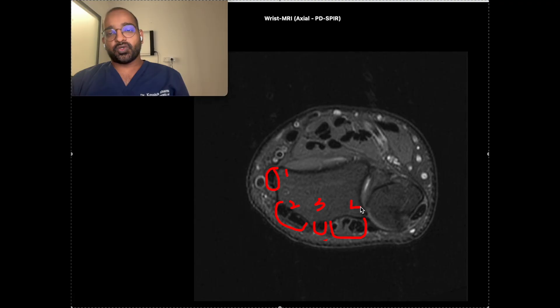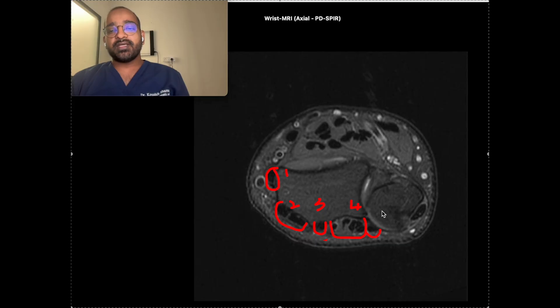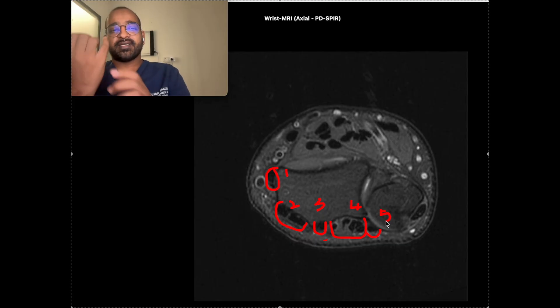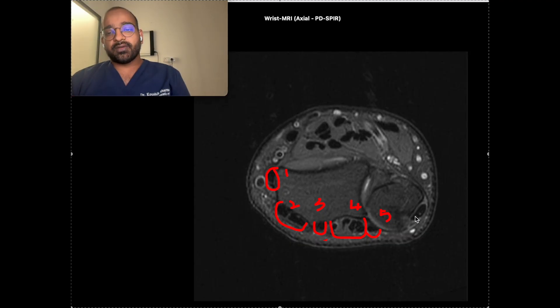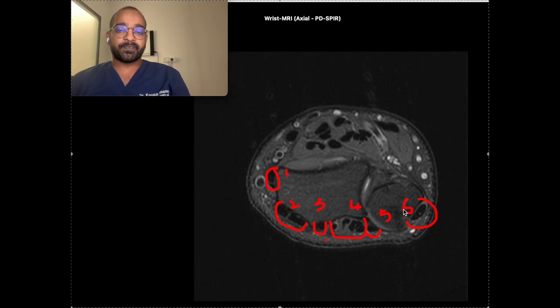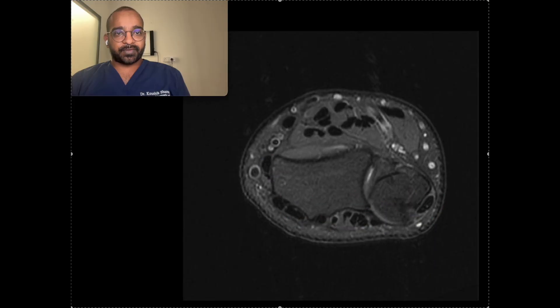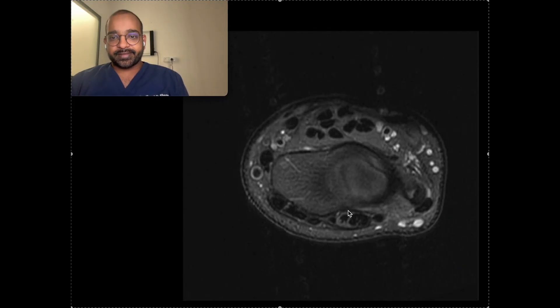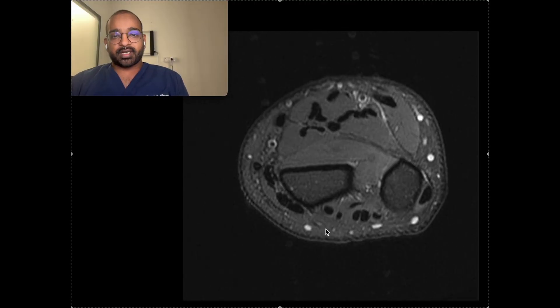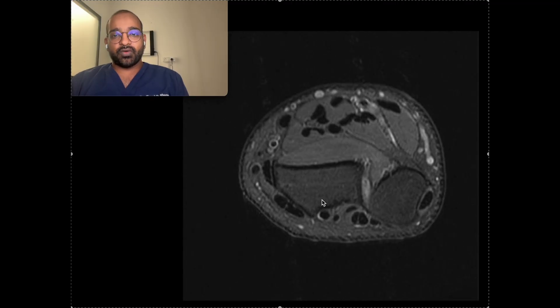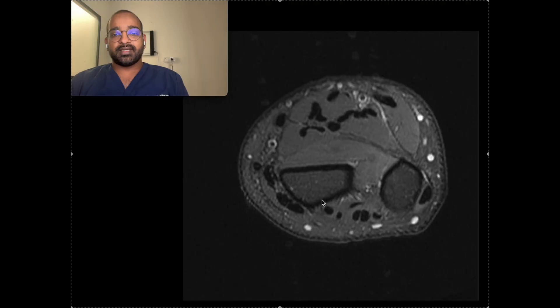The fourth compartment has extensor digitorum tendons and extensor indicis. The fifth compartment has extensor digiti minimi for the little finger. The sixth compartment has extensor carpi ulnaris tendon. These are all the extensor tendons, held in place by the extensor retinaculum.